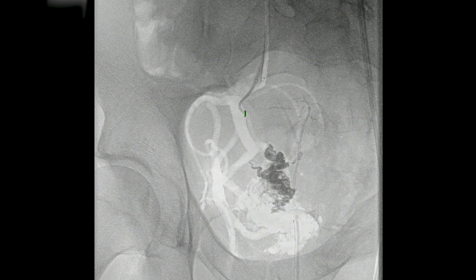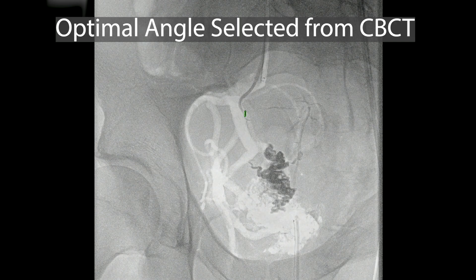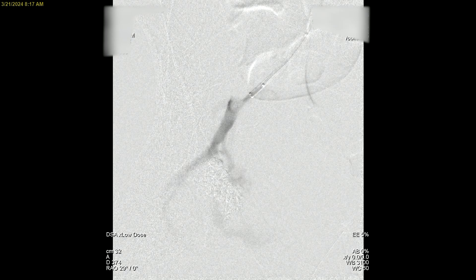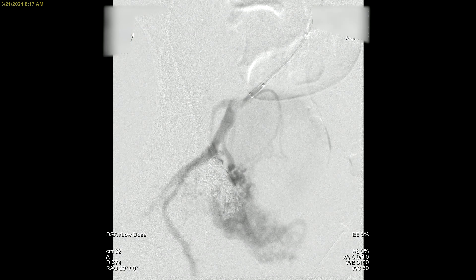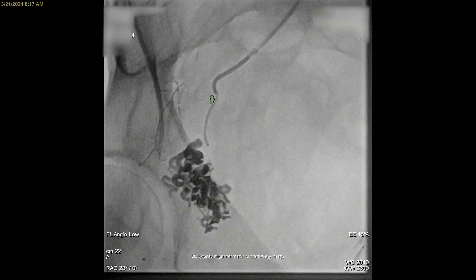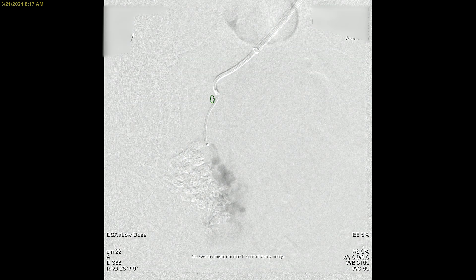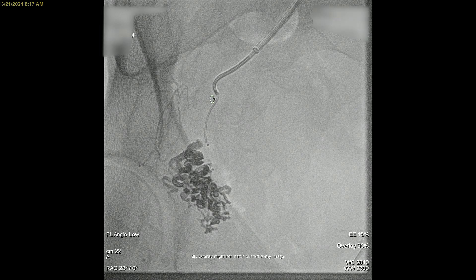That green mark is a fused image where we've marked the optimal angle — what a difference the angle makes, straight into it. Just changing the view, things like this allow you to get the catheter well seated down into the malformation, which is pretty safe. Non-target organ embolization occurs when you've barely got the catheter into the target vessel and things can reflux back into the axial circulation. That's what you're always trying to avoid and watching for.